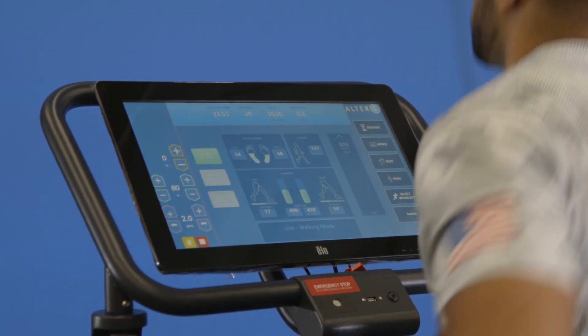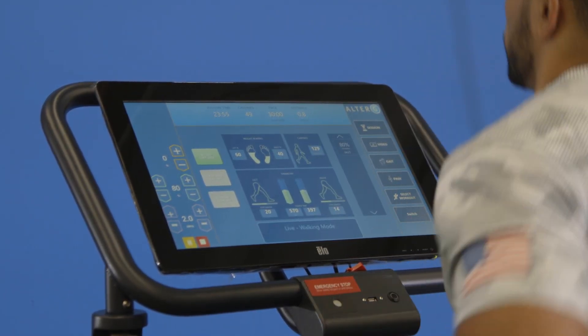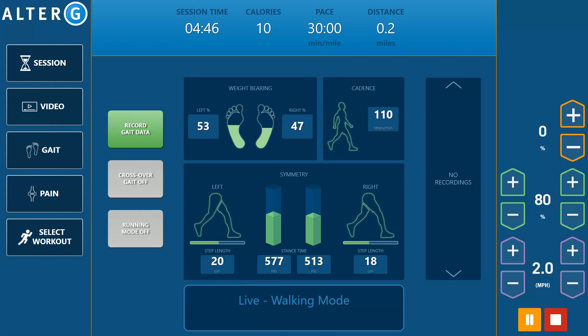AlterG's new touchscreen user interface with integrated Stride Smart, combined with patented differential air pressure technology, shows the direct effects of unweighting on their gait in real time, giving you a clear roadmap to help you design the optimal training parameters to get them back in the game fast.